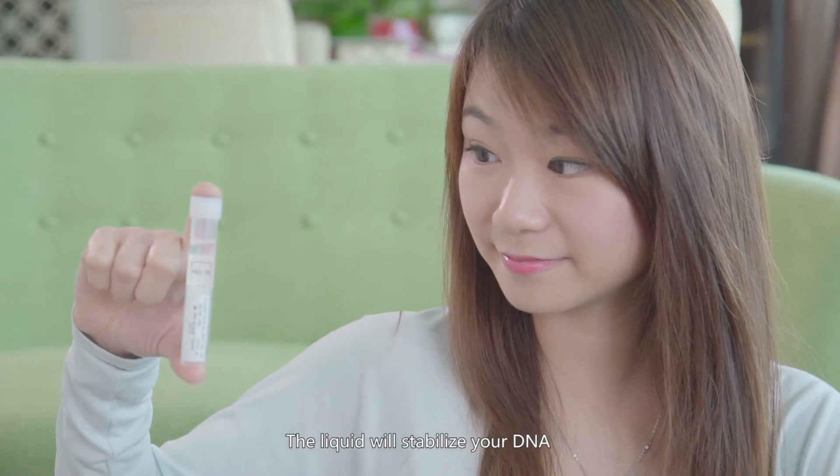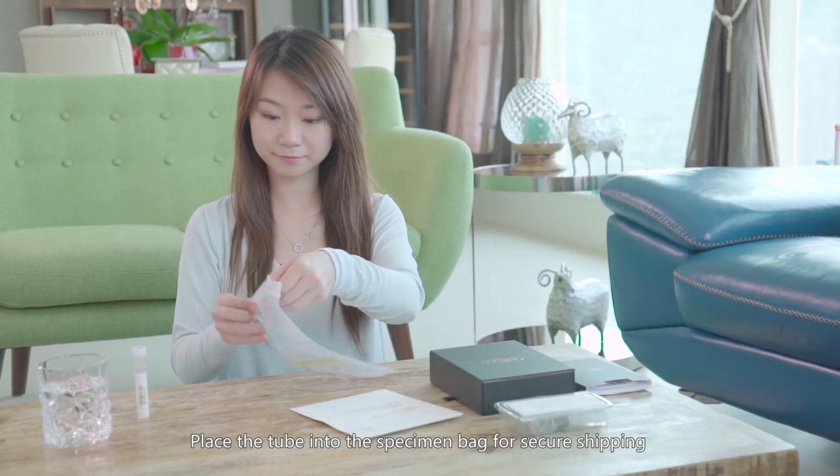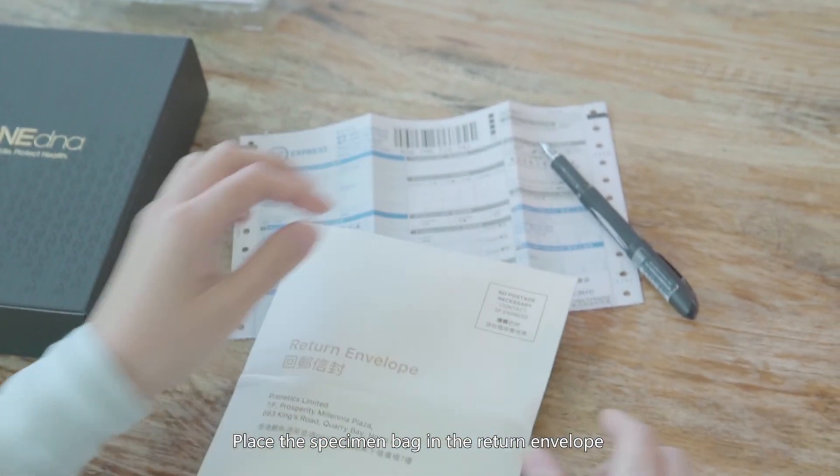The liquid will stabilize your DNA at room temperature for up to 6 months. Place the tube into the specimen bag for secure shipping, then place the specimen bag in the return envelope.